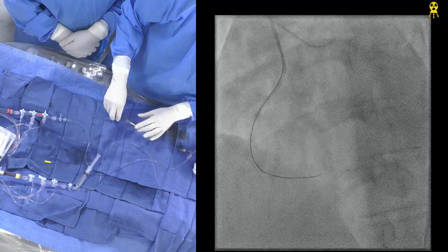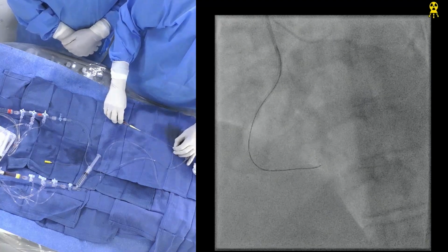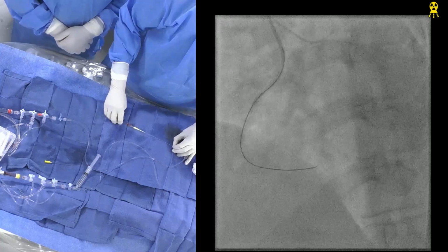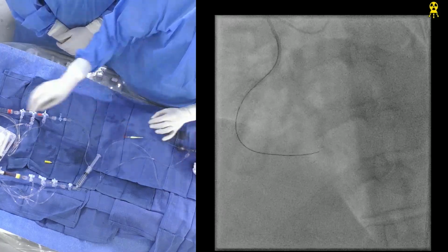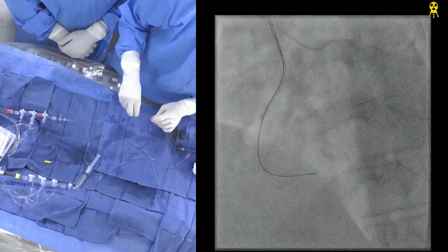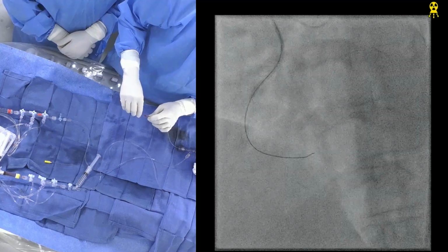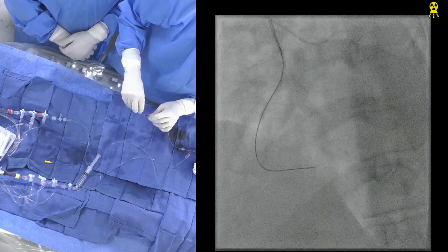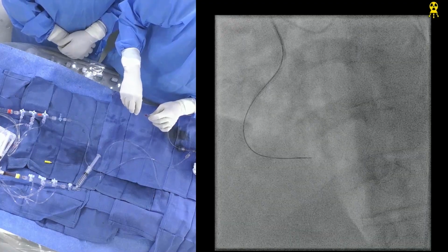The question was, Andu was saying he wants to go to Gaia 3, that's okay. Some want to go to Pilot 200, that's okay. Another would be maybe Confianza 9, people want to go, that's okay. But I think this one would not have been the Fielder XT-A or so, because those are very thin wires. This is definitely a more promising option.